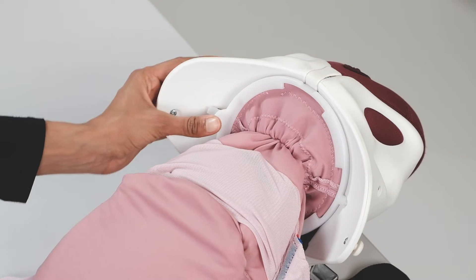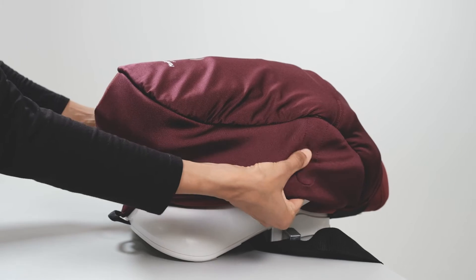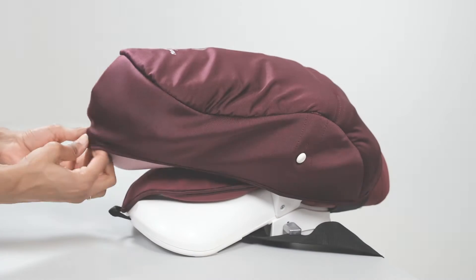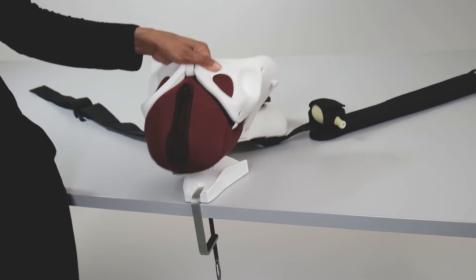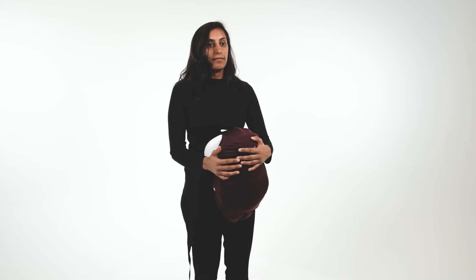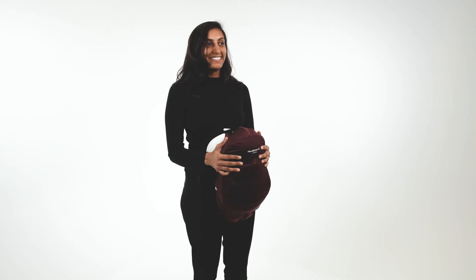To set up, connect the CS uterus to Mama Berthy, then cover with the CS abdomen skin. Mama Berthy CS can be used on a tabletop to demonstrate skills, but it's most effective when worn during simulation.